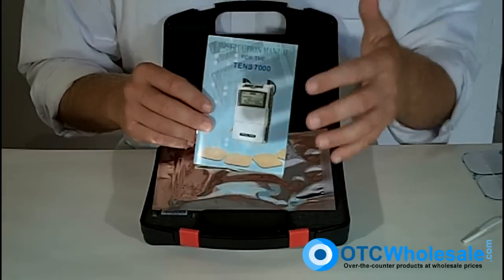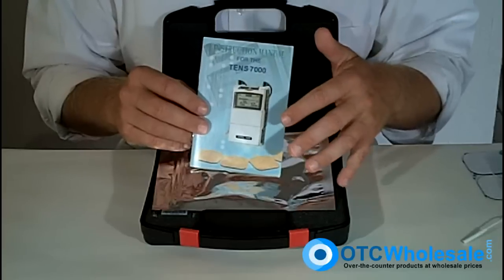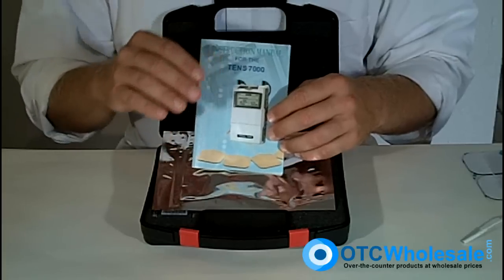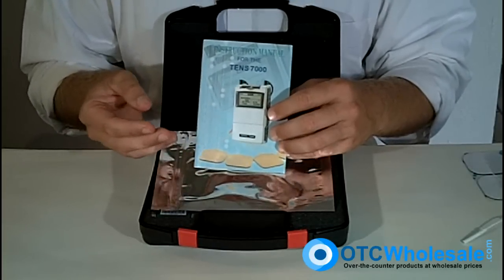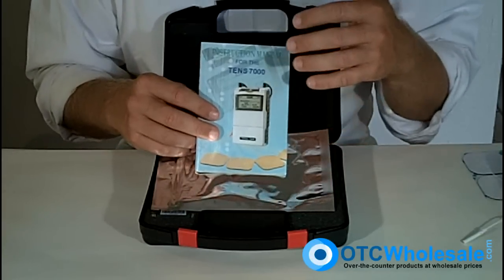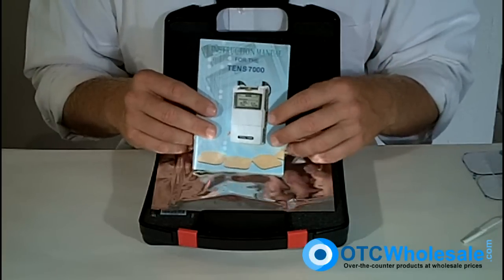The TENS 7000 is by far America's number one TENS unit. There are tens of thousands of these in use today — more than any other TENS unit on the market. It's backed by an American distributor that backs its warranty and the product nicely. Here at OTC Wholesale, we have the best prices on TENS 7000s in the market.